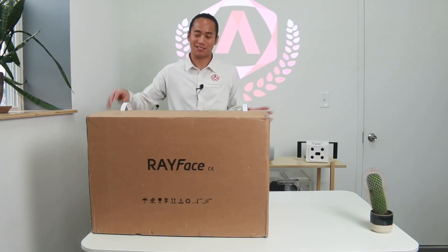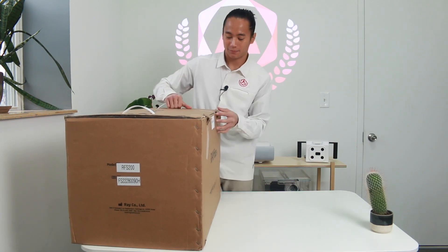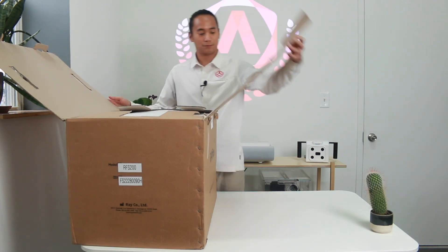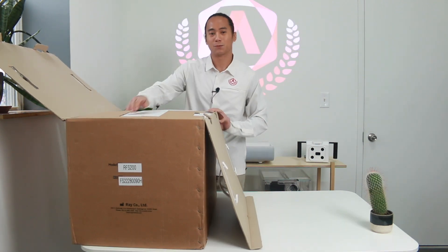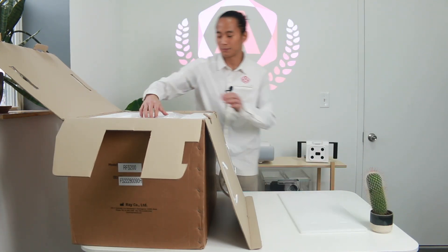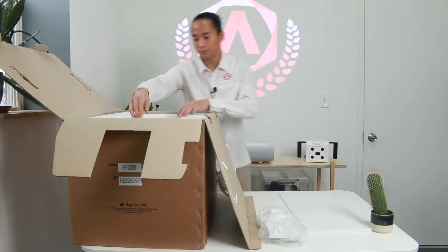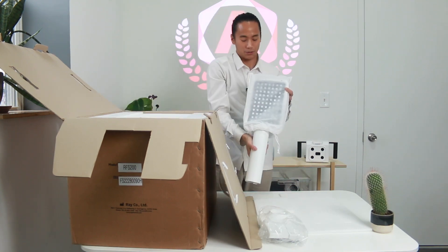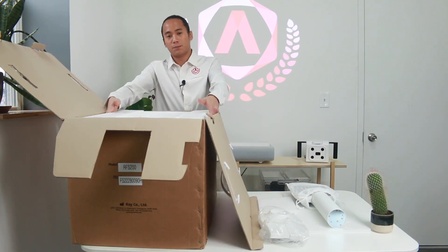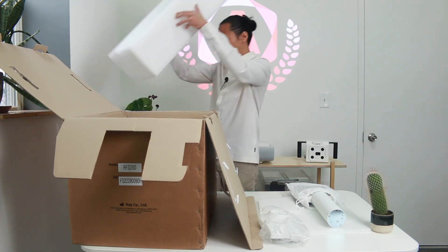First thing we're going to do is unbox it. The first thing we're going to notice is your calibration plate, and this is going to be your stand for the calibration plate. These three pieces of styrofoam can come out as one piece — just come at it from the sides and pull it out together.